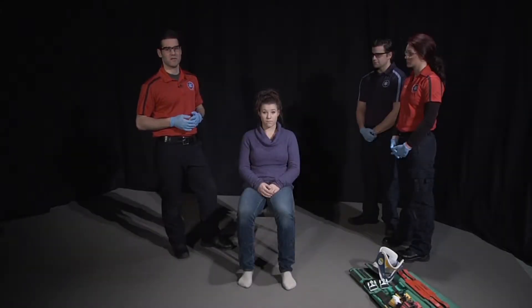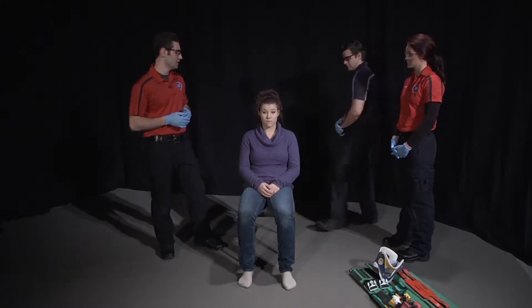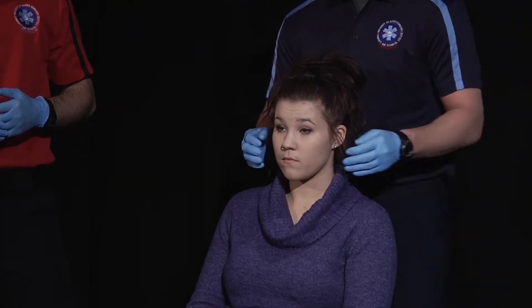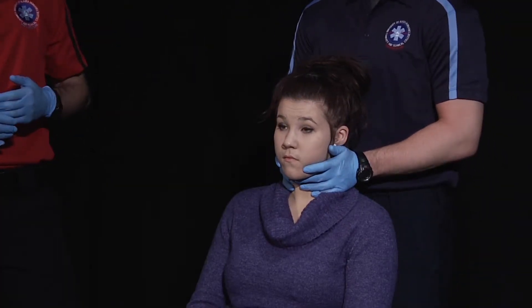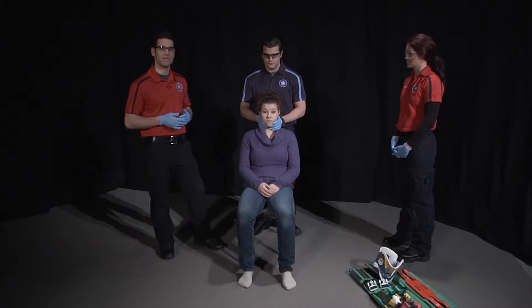Once I've gathered all the necessary equipment, I'm going to have one of my assistants place and maintain neutral inline stabilization of the patient's cervical spine. I'm going to have you continue to hold manual stabilization and assure that the patient is a reliable historian and not altered in any way. I'm going to assess motor, sensory, and circulatory functions in all four extremities.